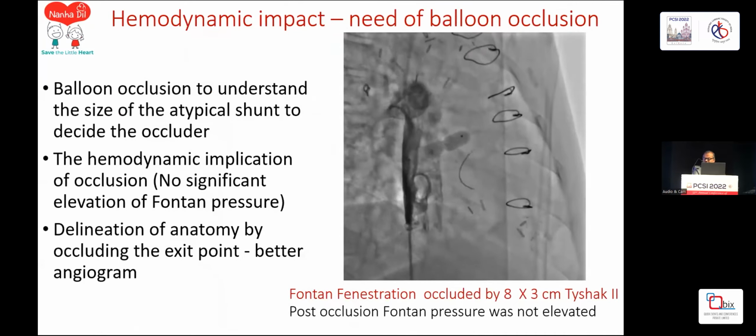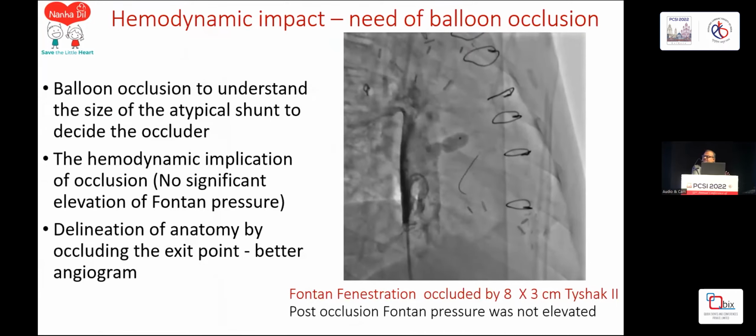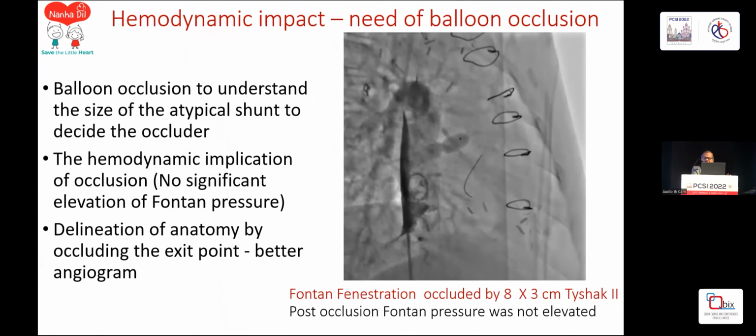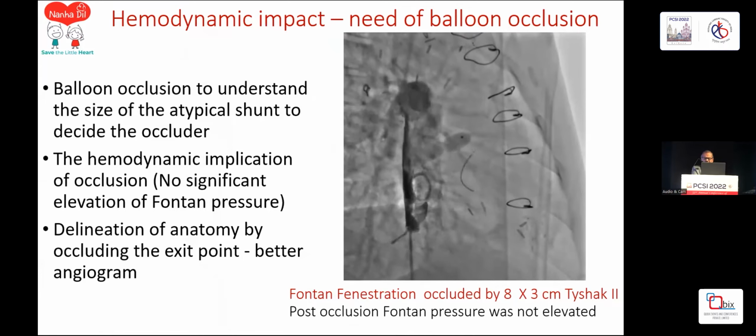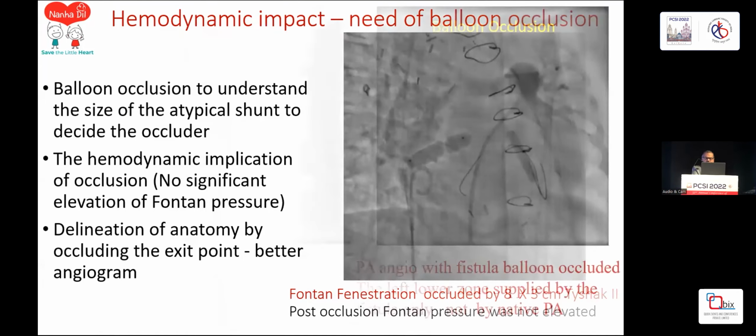Balloon occlusion, in the same patient of the Fontan, tells us what the size of the device is, it helps. And on closure, any hemodynamic implication in that particular case, Fontan pressure, there was not much elevation. And we occluded this particular case with an 8-3 Tyshak balloon.